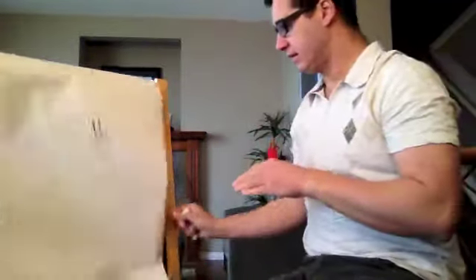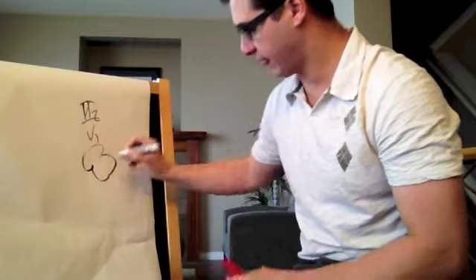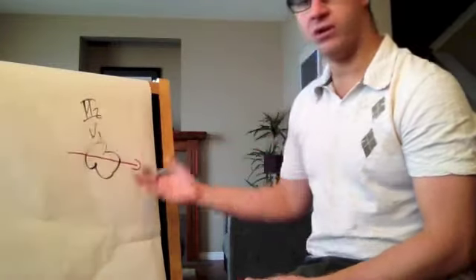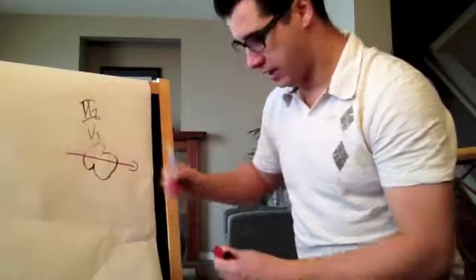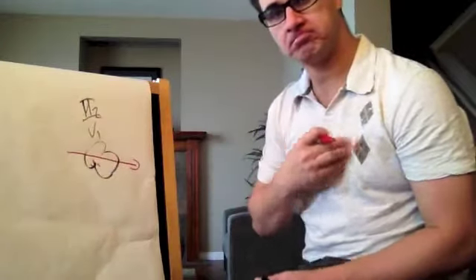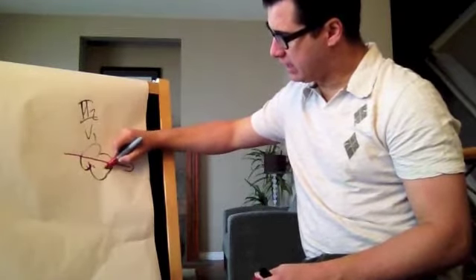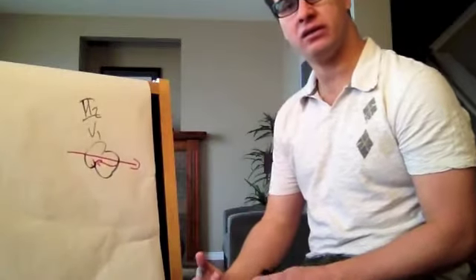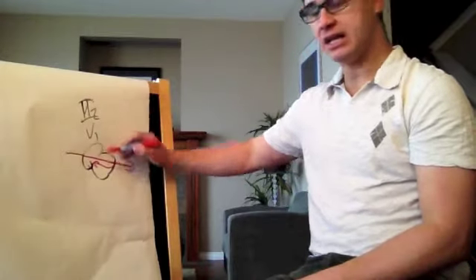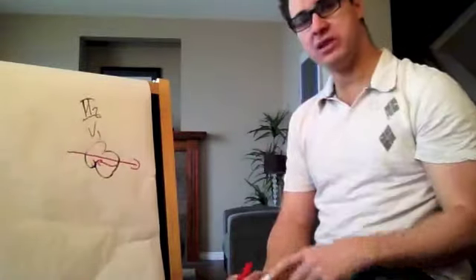Why? Because, again, if you look at where V1 is in our heart, and I'll redo the pictures over here. What we're looking at in lead 2 is the electricity going like this, which is mostly what the electricity is doing. But in V1, because the stickers are right over there, what we're looking at is that if any electricity is going back up, I'll see it in V1. And how would I see it? I'll leave you a few seconds. So electricity, instead of going like this, comes mostly from the ventricle. So what would I see different in my lead V1?